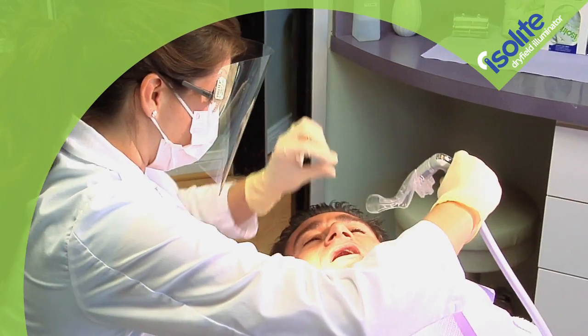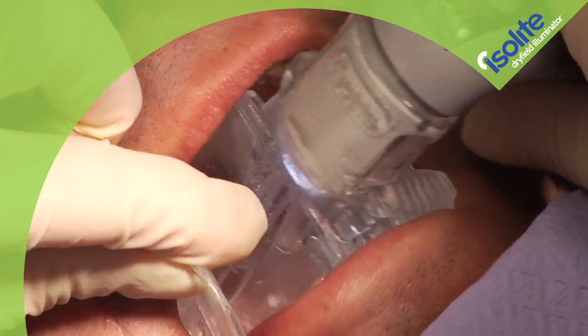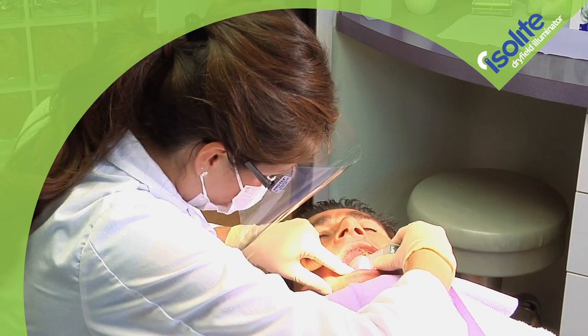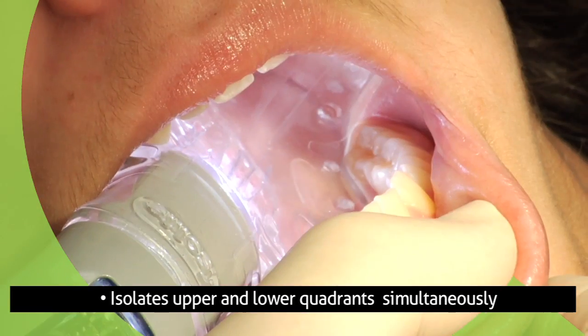At the heart of the Isolite system is the unique patented Isolite mouthpiece. The soft, flexible, non-impinging Isolite mouthpiece isolates upper and lower quadrants simultaneously.